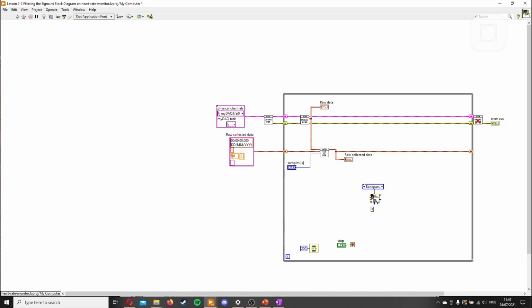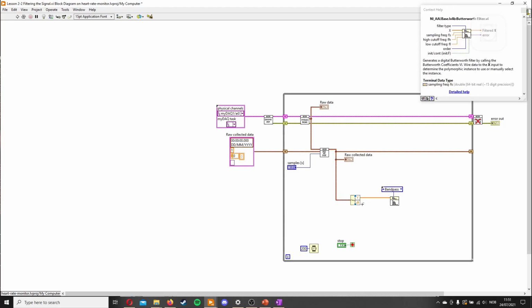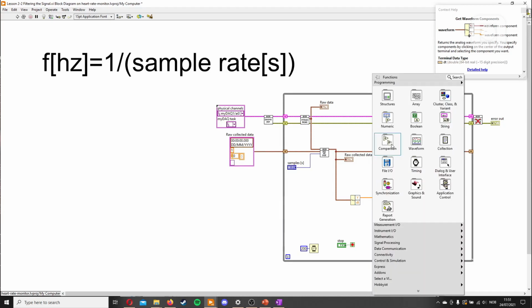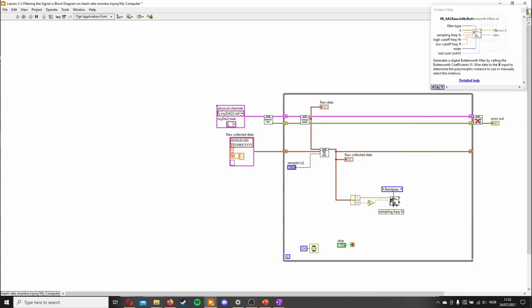Here is where our signal will go in, and as last time, we will need to unbundle this, or as it's called with waveforms, we need to get the waveform. This also needs the frequency in, but we don't get the frequency out here. We get the time between the samples in seconds, which is not frequencies. Frequency is 1 over the time between seconds. So what we need to do is to put out a block which turns the time into 1 over it, so it becomes a frequency.